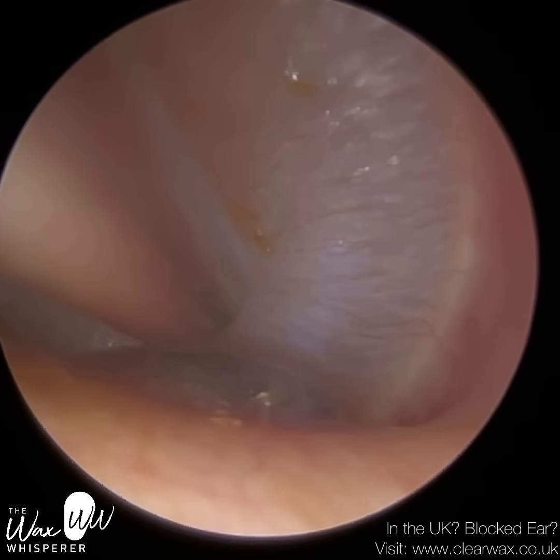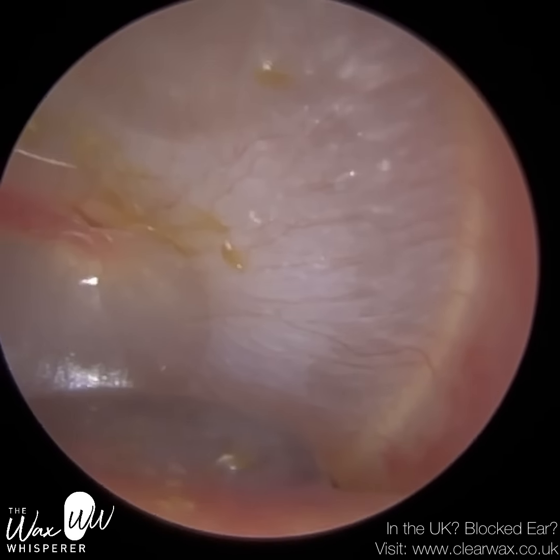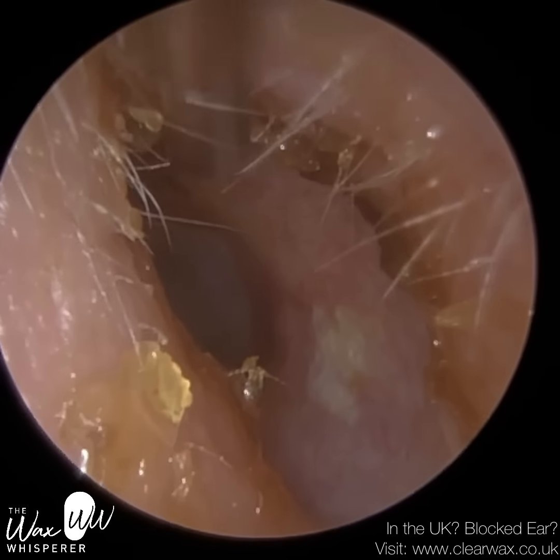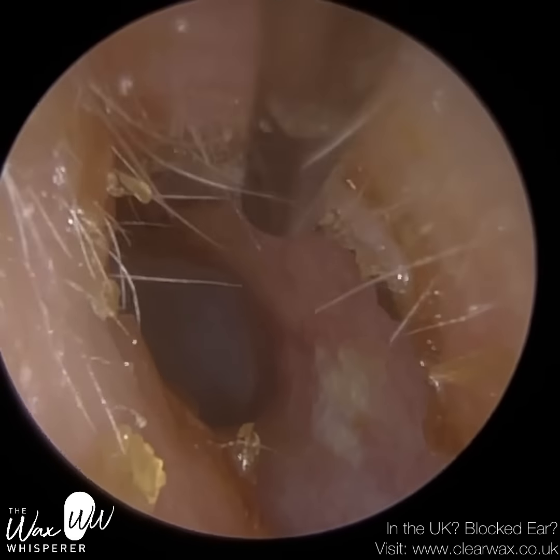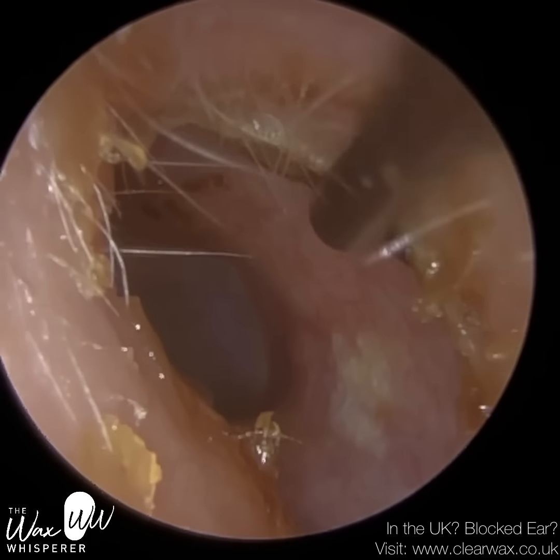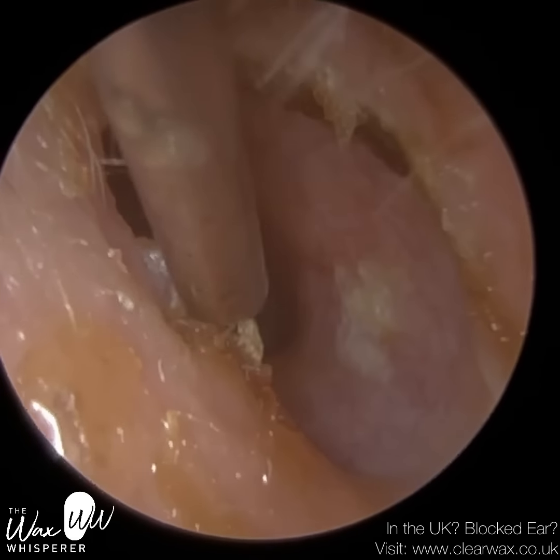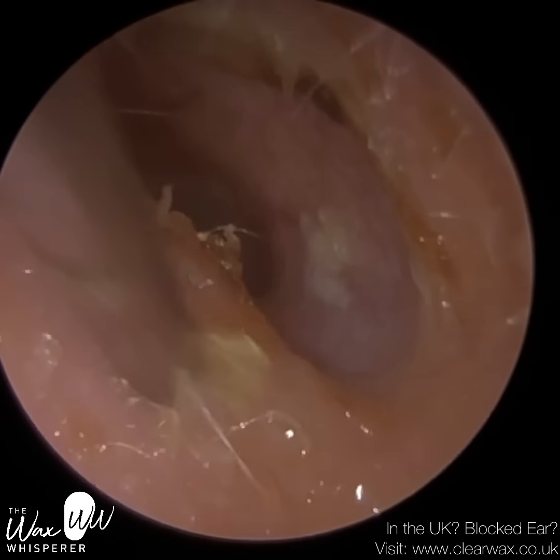I just thought better of it and had a closer look, and I confirmed that it's not wax — it's just a bit of swelling, a bit of edema, which should settle. So I'm mopping up around the entrance, some crusted skin. You can see the patient's got very elongated ear canals — very slit-shaped. In all of our ear canals the height is greater than the width, but in this patient the height is much greater and significantly longer than the width, giving it an oval shape as opposed to a more circular, spherical shape. I'm using the fine suction probe to get as much of this crusted skin away as possible.